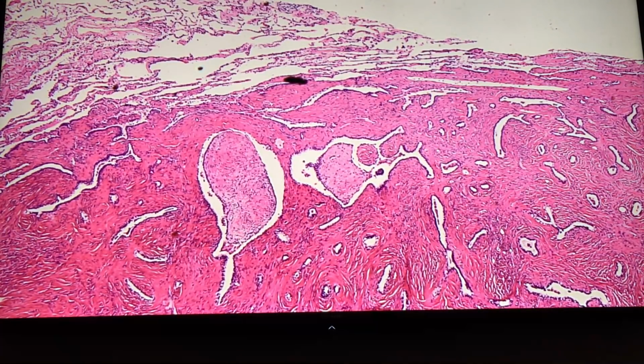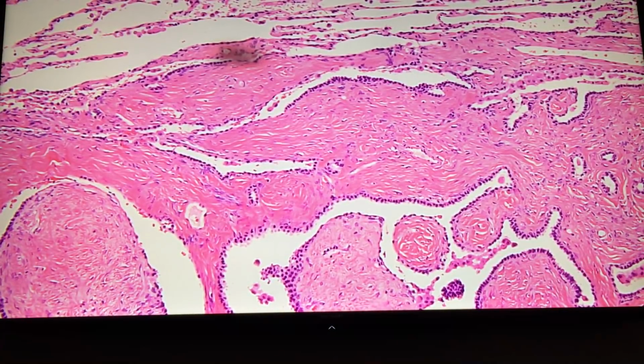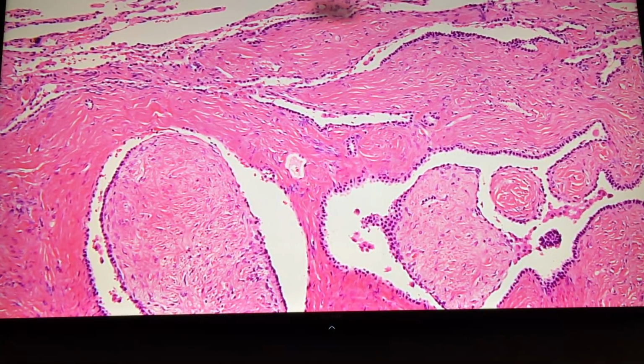And just show them the high mag here, Aaron. What kind of lesion is it? What kind of cells? Spindle cells. Can you guess what this is? Yes, we're again in a solitary fibrous tumor. This is now a little more hyalinized looking than the other one. But essentially in the lung, this is what happens. It can get more hyalinized looking, it can have more cellular areas. Rarely the cellular areas can become malignant, and so you can have a malignant SFT. But most solitary fibrous tumors in the lung have a good course, especially if they're small and bland looking like this. Okay? Next case, Aaron?